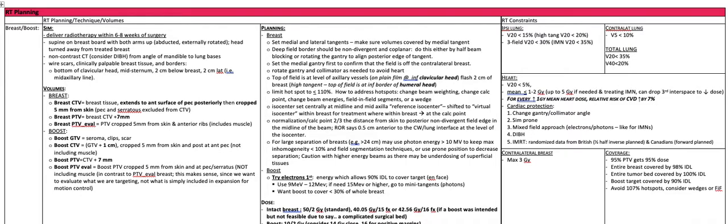For the boost, the boost GTV is your seroma and clip or scar. The boost CTV is the GTV plus one centimeter, cropped five millimeters from the skin and posteriorly at the anterior pec, so it does not include the muscle. The boost PTV is the CTV plus seven millimeters. The boost PTV eval is the boost PTV cropped five millimeters from the skin and at the pec-serratus, not including the muscle — in contrast to the PTV eval of the breast. This makes sense since we want to evaluate what we are targeting, not simply what is included in the expansion for motion control.